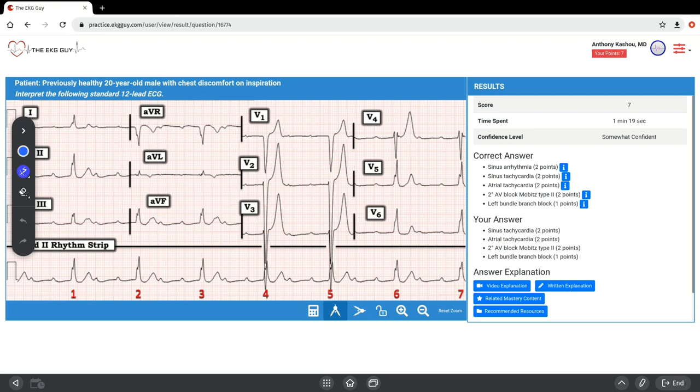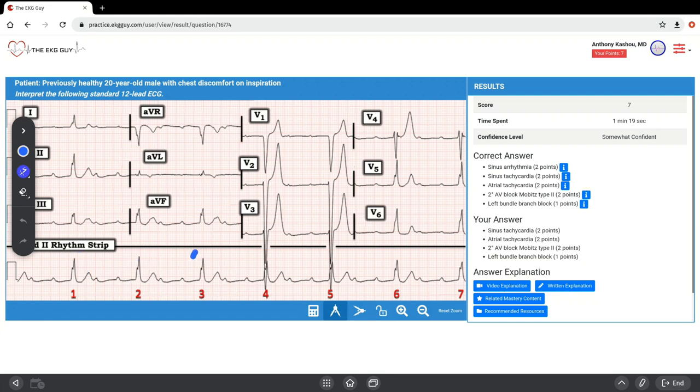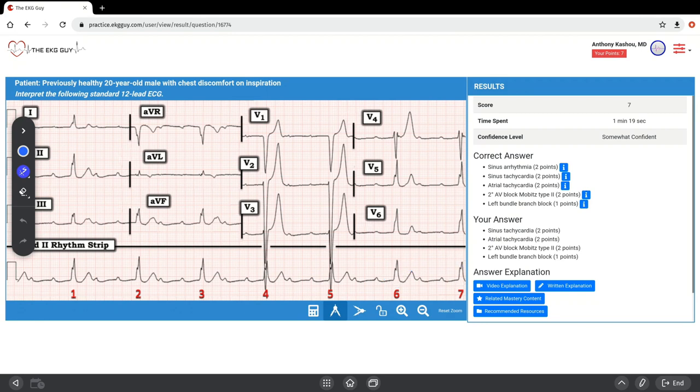The ventricular rate is about 42 beats per minute. We get that by assuming this is a 12-lead ECG that's 10 seconds in duration. If we count the QRS complexes going across: 1, 2, 3, 4, 5, 6, 7, and multiply that by 6, that's an estimate of about 42 beats per minute.